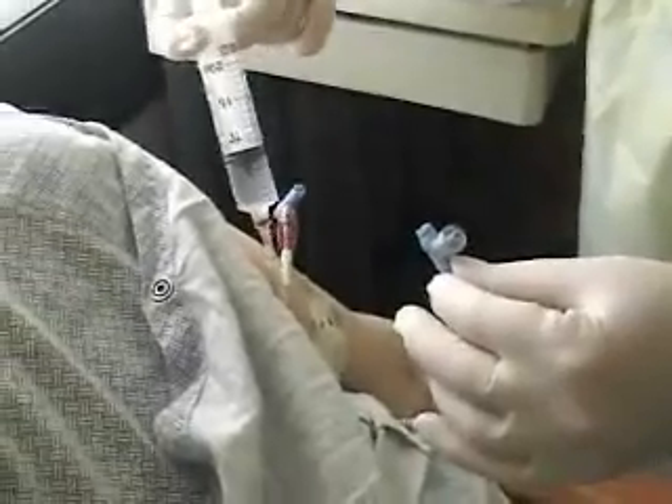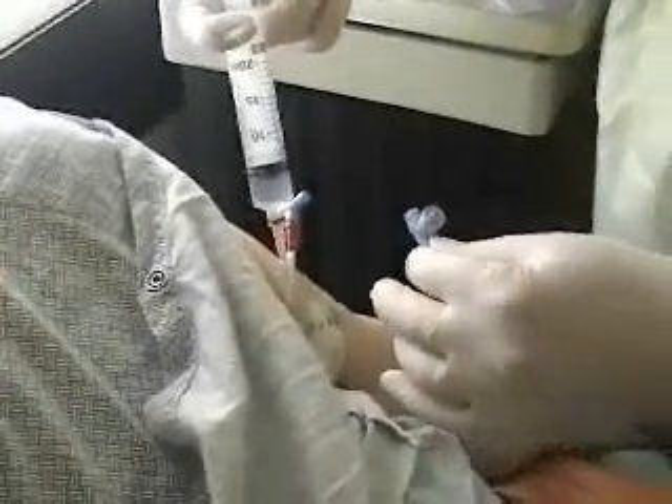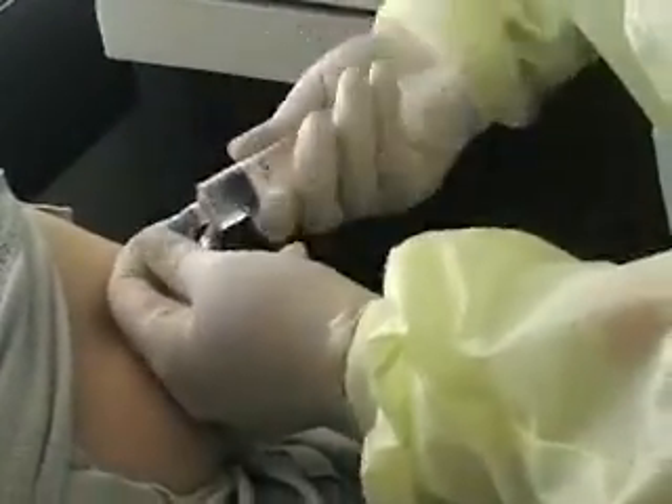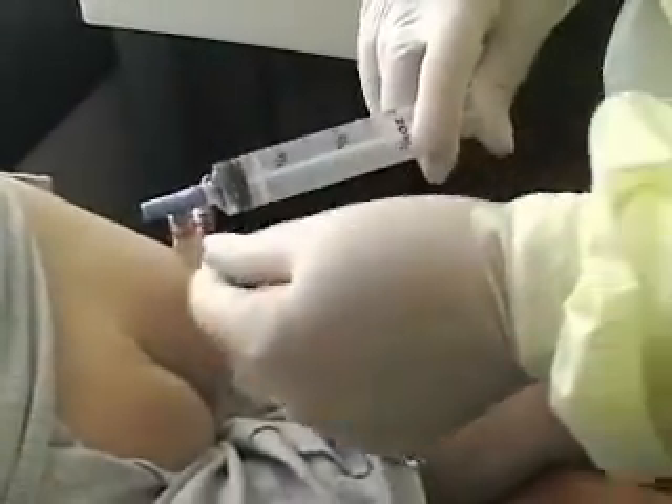Once again, flush and stop, flush and stop. After I'm going to flush the rest through the connector port, just so it's clear too.